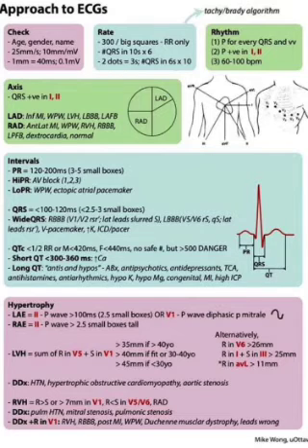Axis: QRS is positive in 1 and 2. Left axis deviation occurs in inferior MI, WPW, LV hypertrophy, left bundle branch block, and left anterior fascicular block. In right axis deviation, the possibilities are anterolateral MI, WPW, RV hypertrophy, right bundle branch block, left posterior fascicular block, dextrocardia, or a normal variant of right axis deviation.